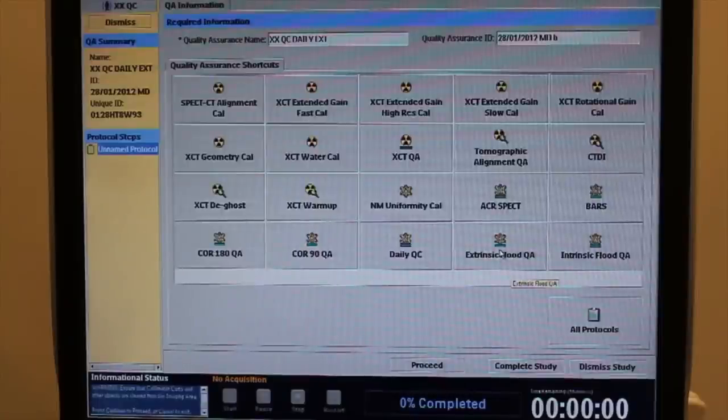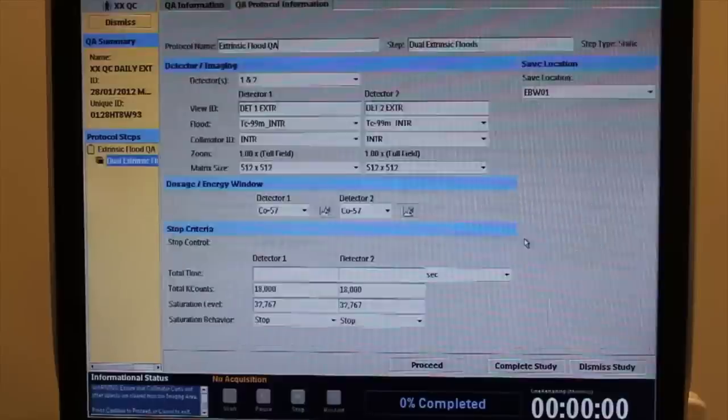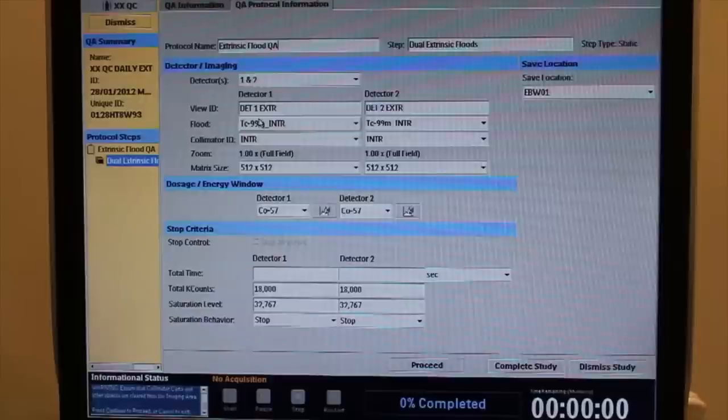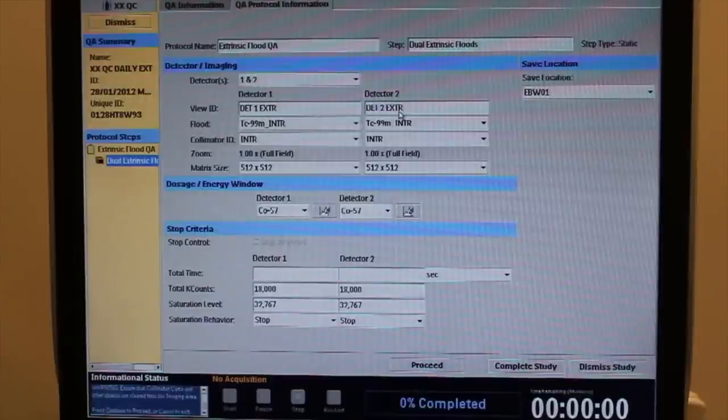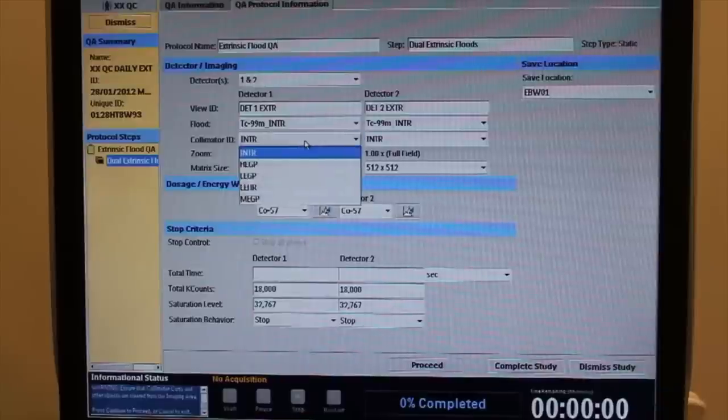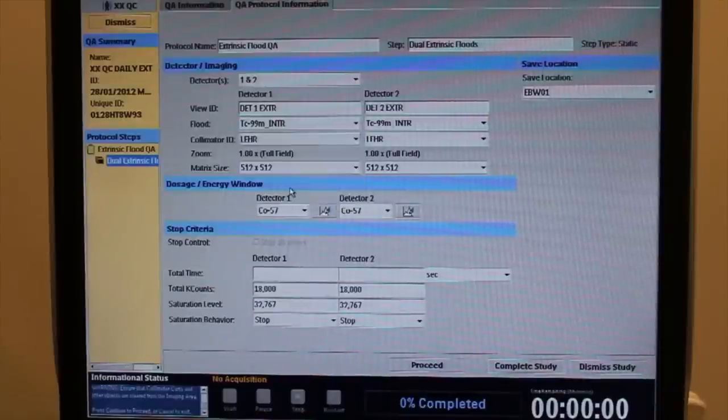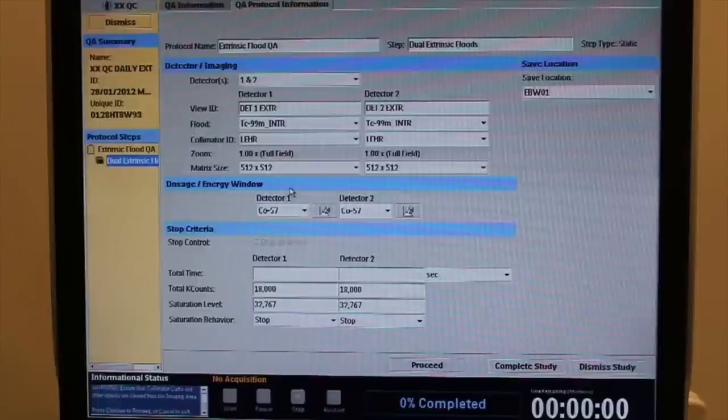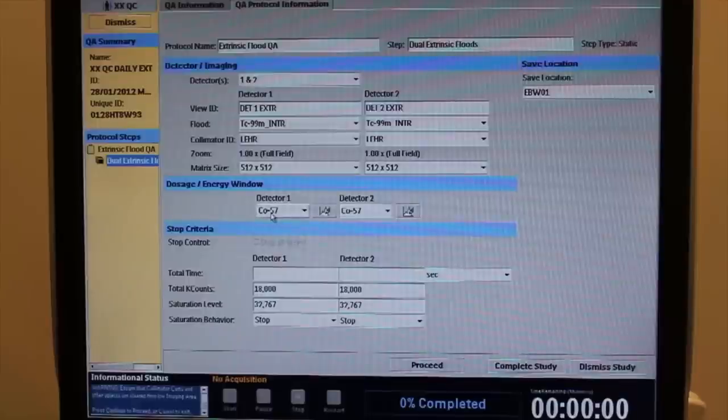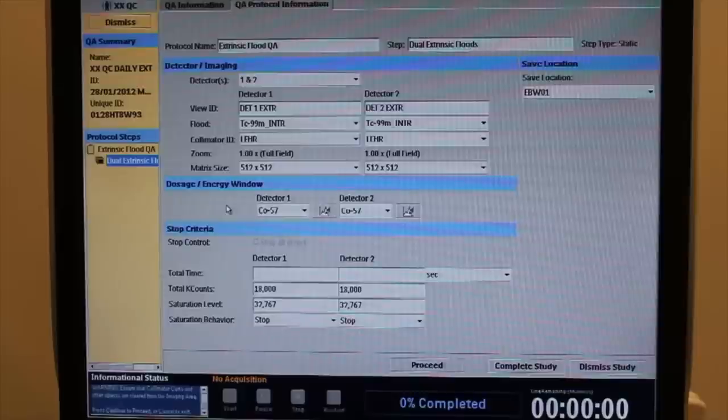Initiate the Extrinsic Flood QA program protocol. Update the correct collimator ID. Ensure that the acquisition is set for 18 million counts. Select the appropriate isotope.